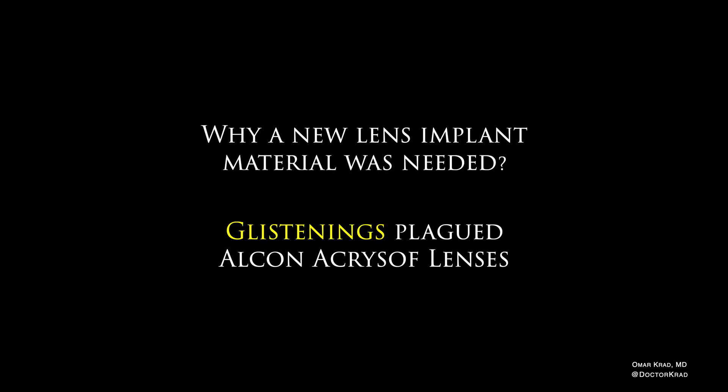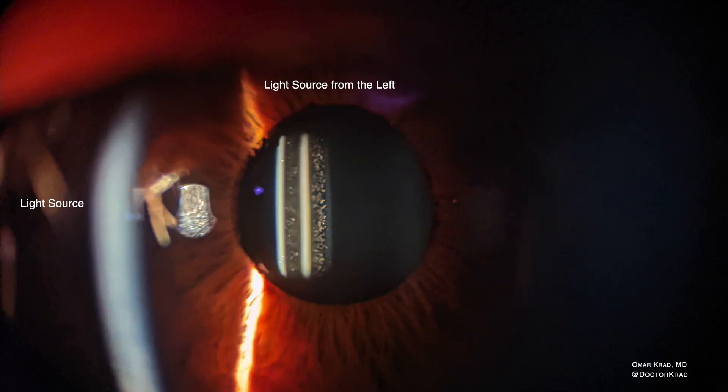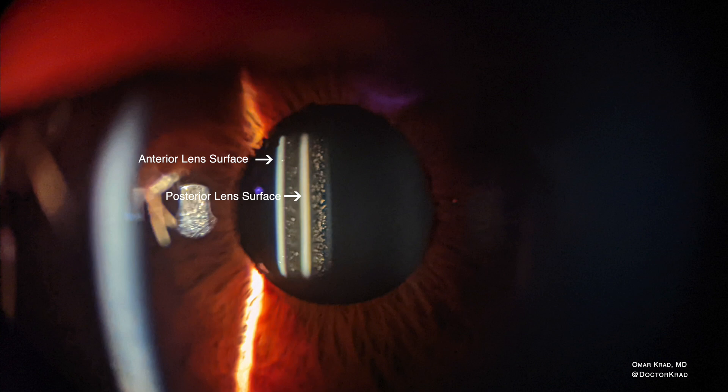A new lens implant material was needed because the older generation of Alcon AcrySof lens implants tended to form glistenings in the lens material. In this image, you have light coming from the left hitting the anterior lens surface, bouncing off the posterior lens surface, and coming back to the front — and in between you can see these little dots. These are called glistenings, and they are within the lens material itself.